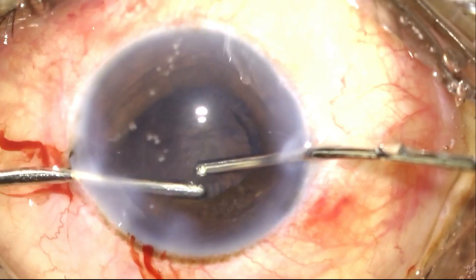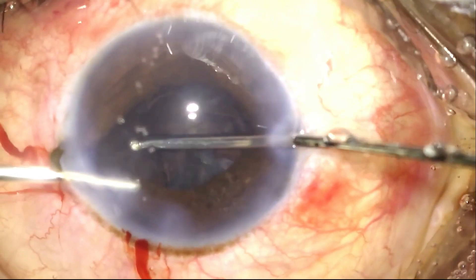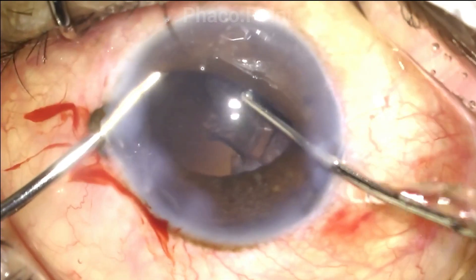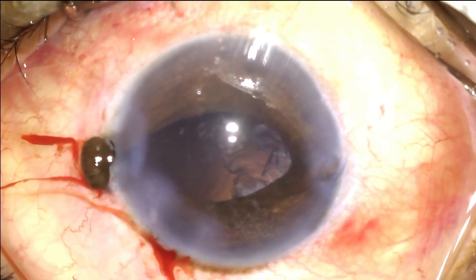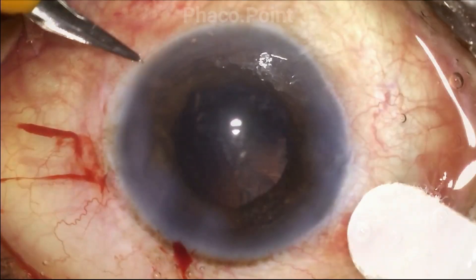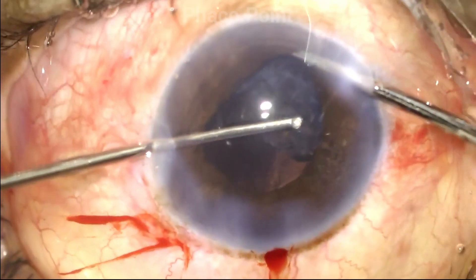Following nucleus emulsification, we proceed with irrigation and aspiration. You will notice the iris prolapsing through the left side port incision. The reason this is happening is because the incision created was much larger than actually required for phacoemulsification. At this point, it would be in the best interest to stop the surgery, reposit the iris, and then either hydrate the side port and watch for wound stability, or take a suture and create a new side port and complete the irrigation aspiration using the newly created incision. I use the iris repositor to gradually nudge the iris back into the eye, and having created a new paracentesis incision of suitable size, I proceed to complete the irrigation aspiration.